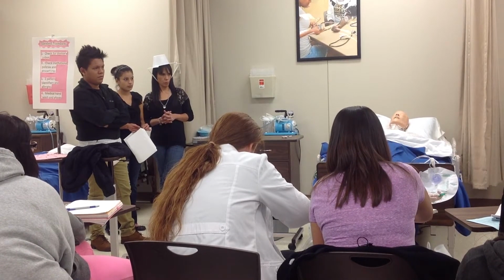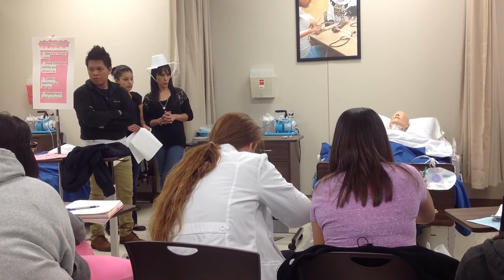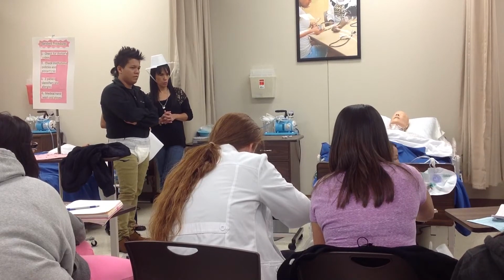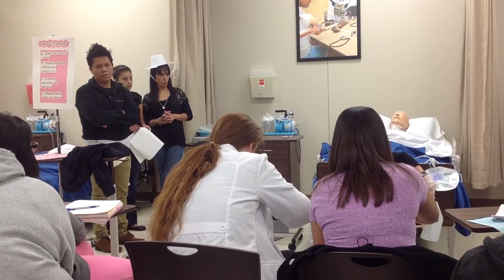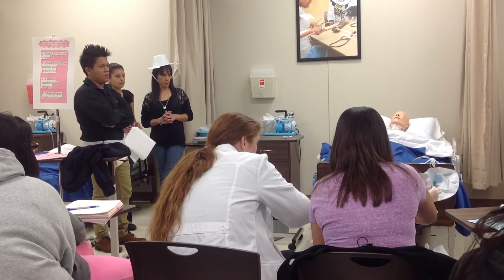And unclamp this valve of the CDU. After you unclamp it, there's one more clamp that you have to press on so that the urine will flow down to the urinal. So you go ahead and press that one. And then let's say that it's all empty.